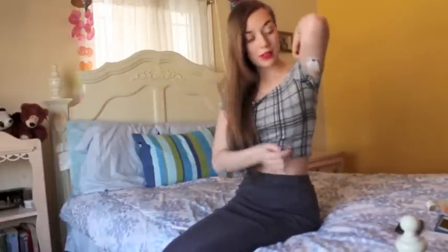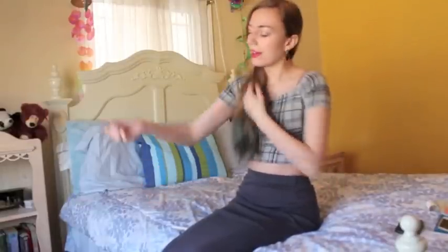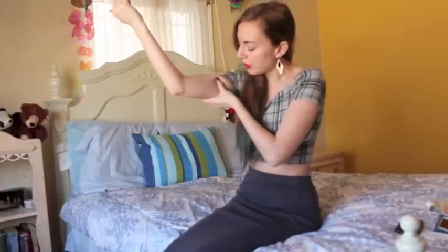So the site change that I'm going to be doing today is from this arm to this arm. So I currently have it right here, and what I'm going to do is get another Omnipod, a new one, and put it right here in approximately the same spot. I might do it a little bit lower or higher than usual because I still have a mark from where I put it there last time.